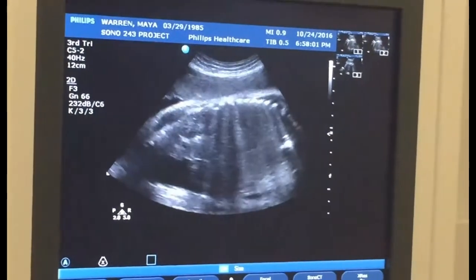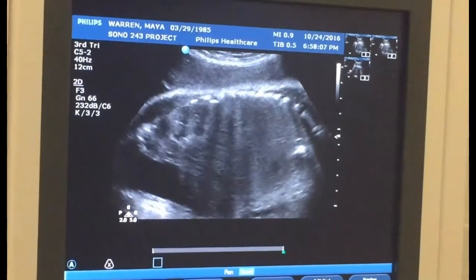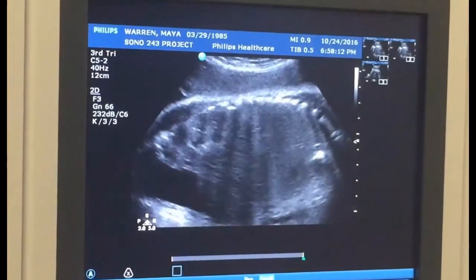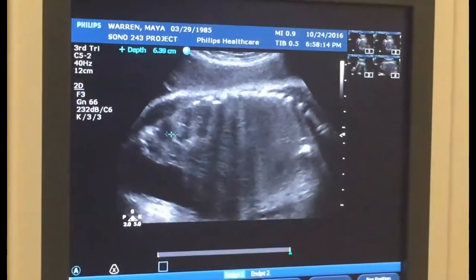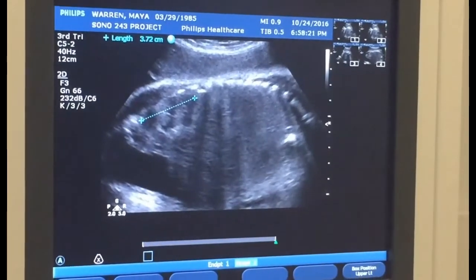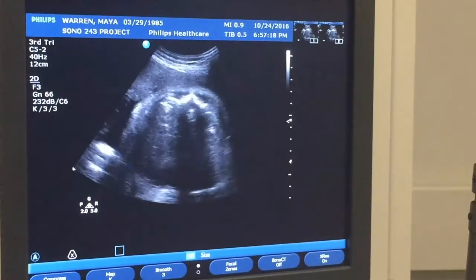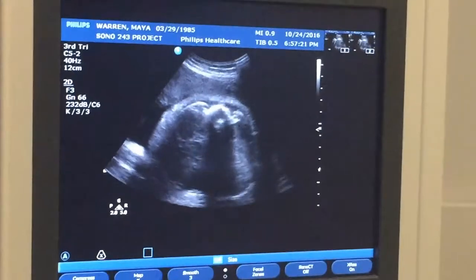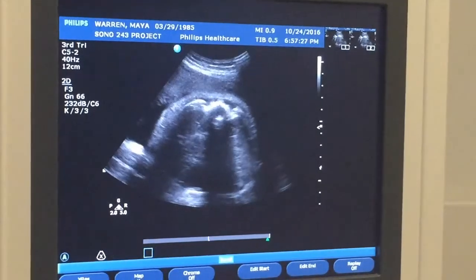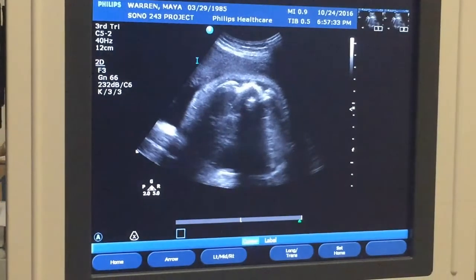After obtaining the abdominal circumference measurement, you need to continue working down the fetal abdomen to display the sagittal kidneys. The normal renal measurement should be between 1 to 4 centimeters depending on gestational age. Then turn the transducer 90 degrees after getting your sagittal image, and take note of the size of the renal pelvis. If it appears to be enlarged, measure the AP diameter.